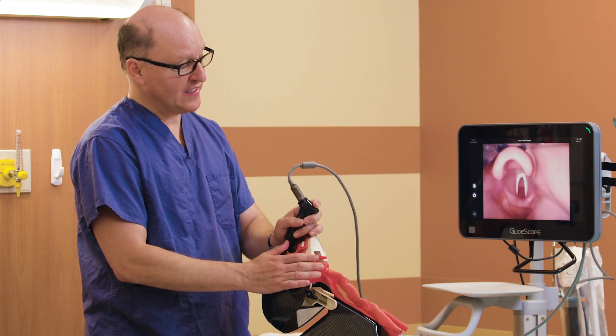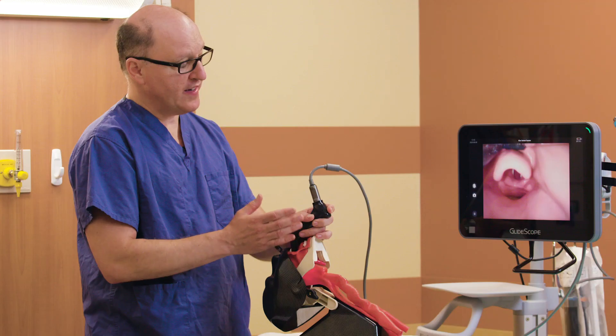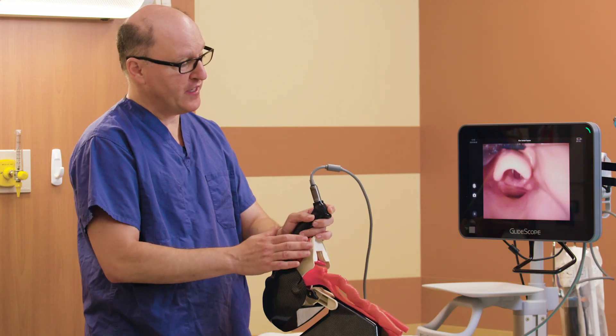We want to avoid over-insertion. This three is more than adequate to provide an excellent view with enough space for tube delivery.